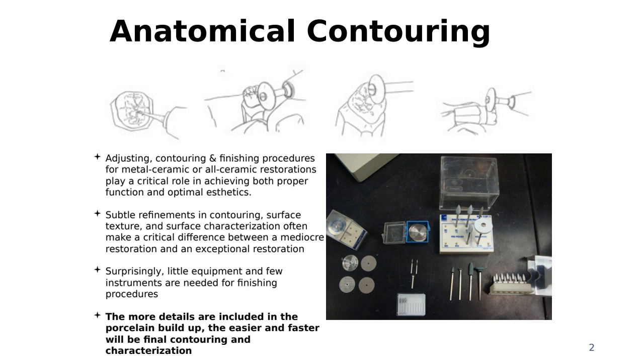What do we mean by generic or mediocre? Okay, it's there. You can tell it's a fake tooth, but it functions well, so the patient is kind of okay with it, right? What's an exceptional restoration?